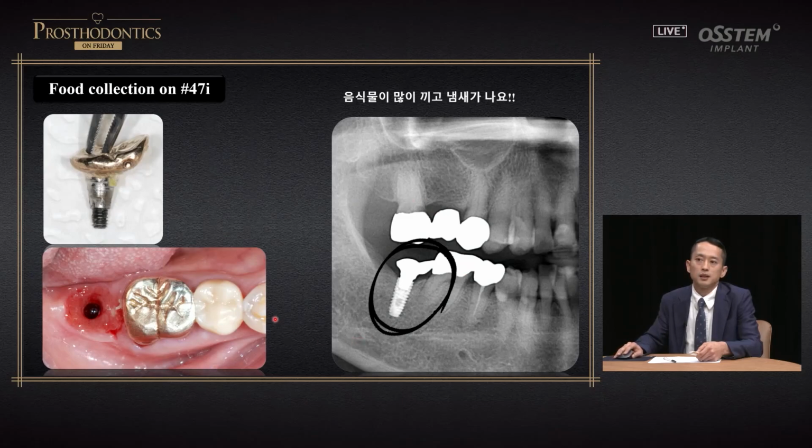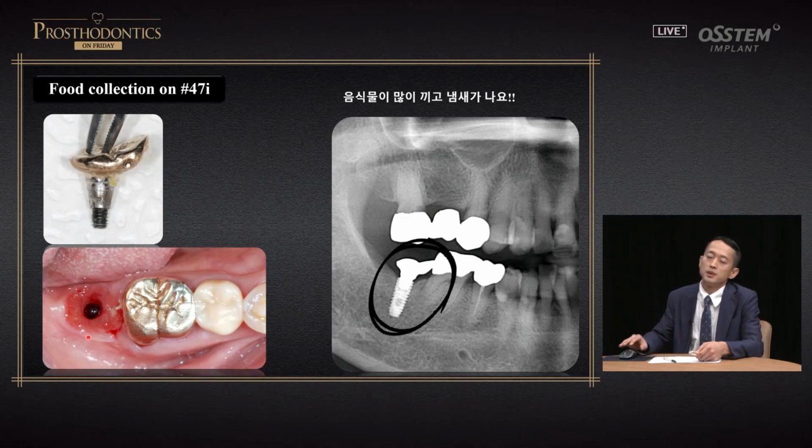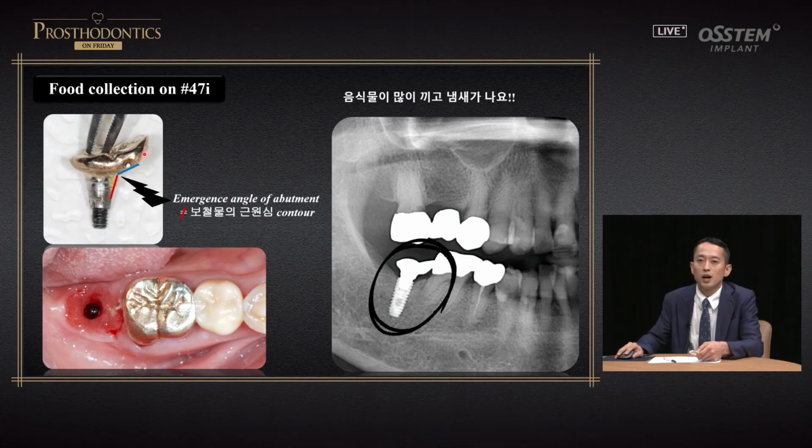So this is recommended in those cases. This is my peer's mother in number 47. There was a severe food impaction as well as bad odor. The patient wanted to solve this issue even if it meant removing the implant.